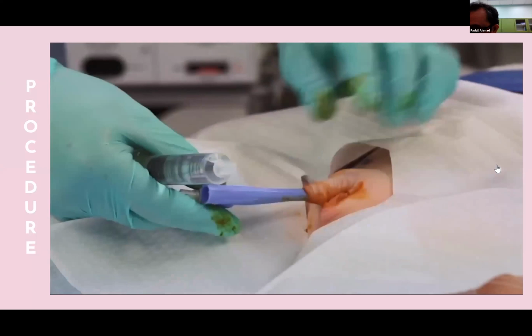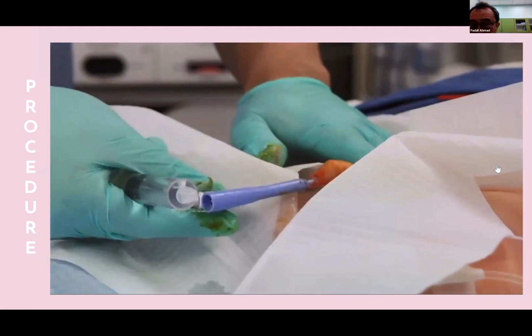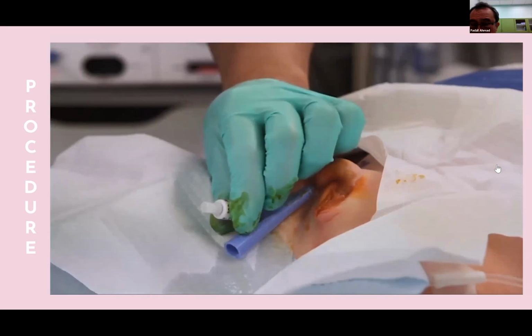As we discussed previously, once the catheter has reached the bladder, urine should flow freely out of the catheter. However, it is not uncommon that the lubrication used for the catheter placement can plug up the opening and prevent urine from freely coming out. Sometimes flushing the catheter with a little bit of water may help. At any time there's no adequate flow of urine from the catheter, it should be flushed with water gently to confirm that you are indeed in the bladder.